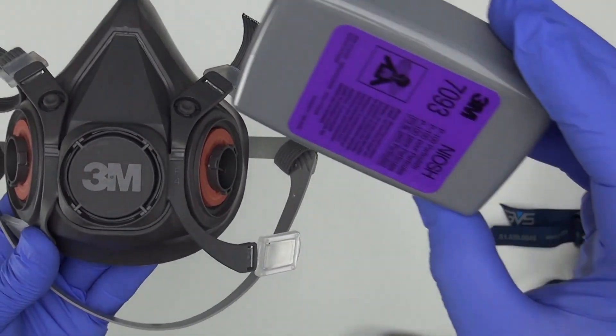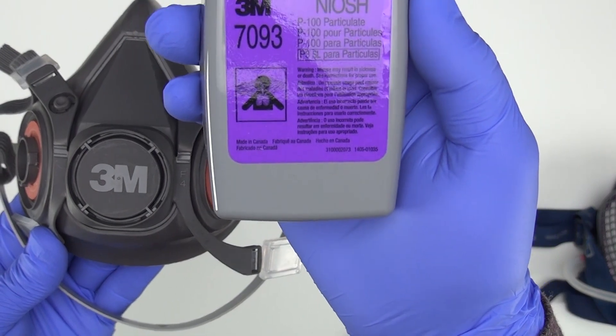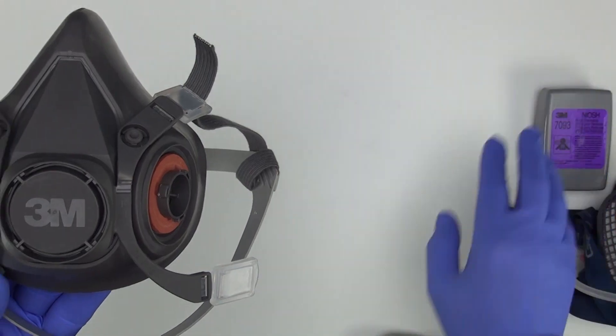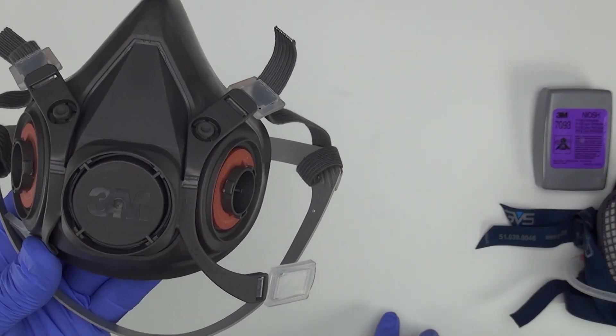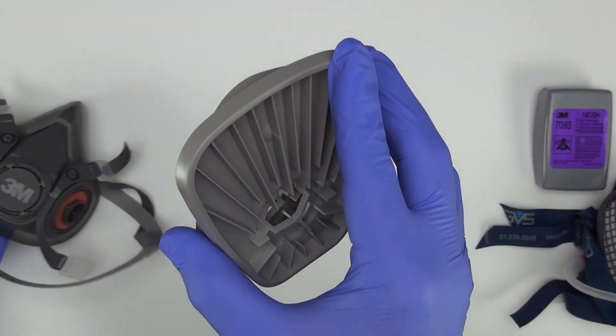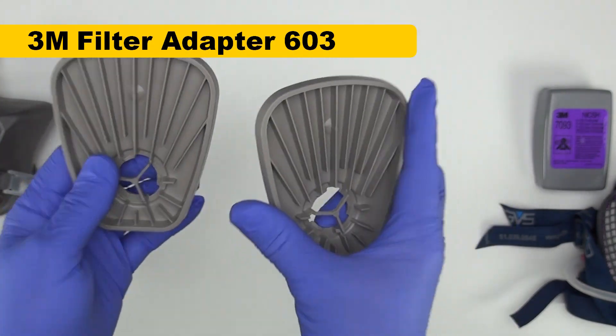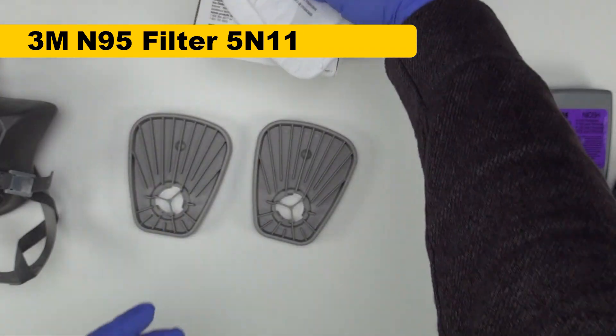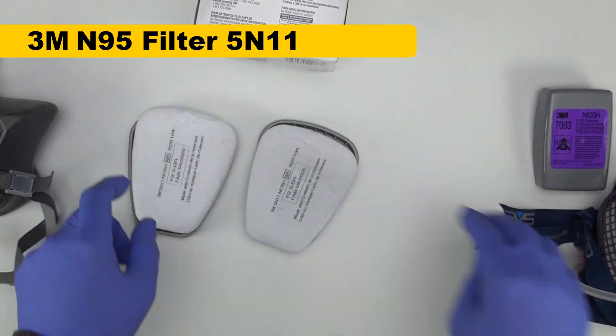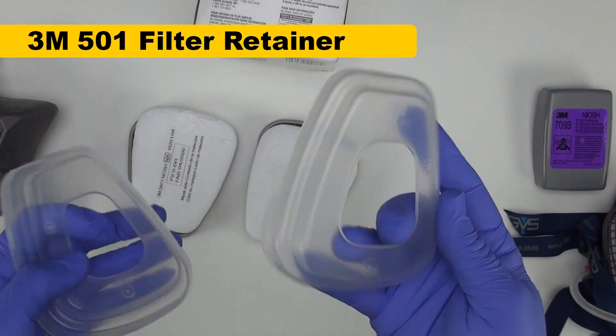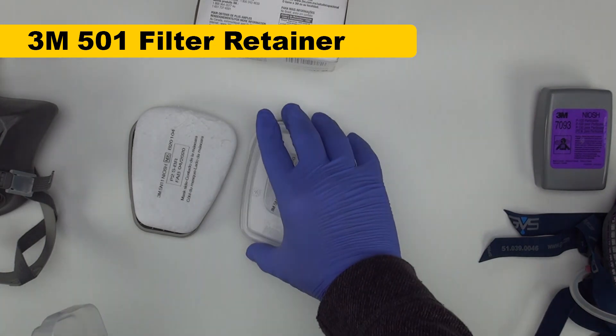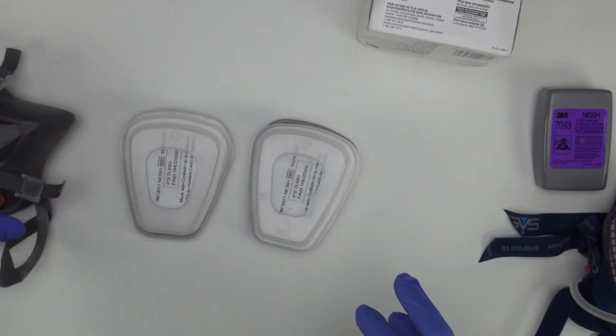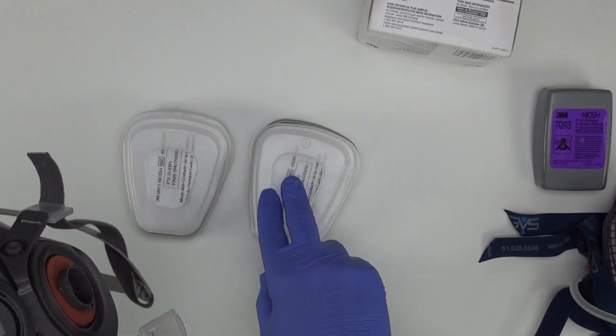And then you can buy these 7093 cartridges, or you can put together a combination to create N95 cartridges, which means you have to buy these bottom plates, buy a box of these filters, and separately buy these filter covers. That turns out to be kind of inconvenient just to get filters for this mask.